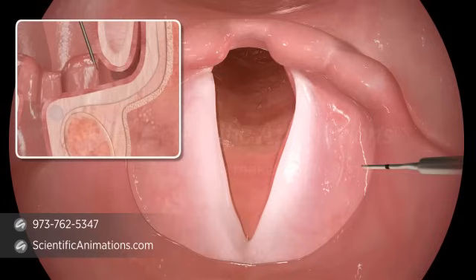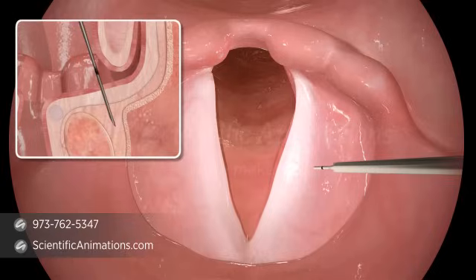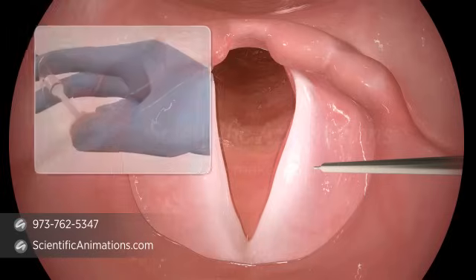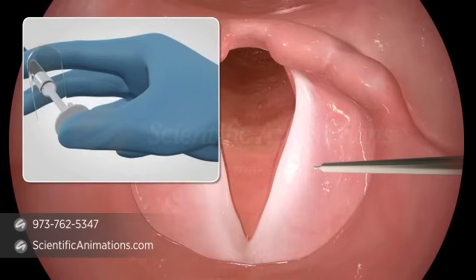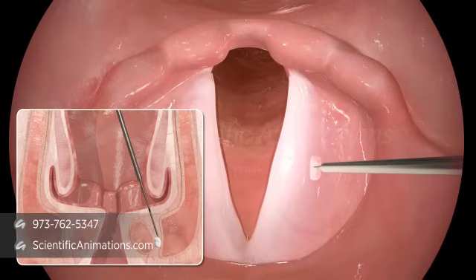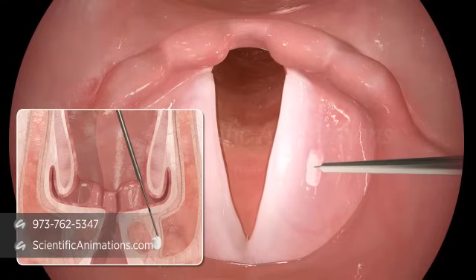Select the location for the injection and insert the needle until the 5 millimeter depth marker just disappears from view. Start the injection while observing the infraglottic tissue where the injection will first be visible. Continue to inject under telescopic or microscopic visualization until the desired augmentation has been achieved.